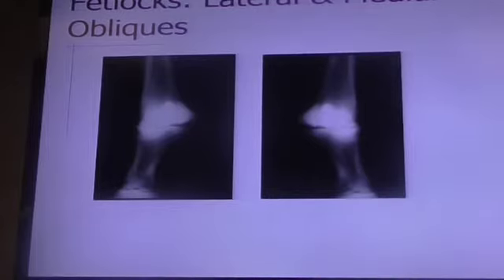Is that endorsement or you want to just use that? You're looking to go back to the ladder. All I want is medial or lateral. Lateral. It's not lateral, is it? This is a dorsal medial palmaro lateral oblique.